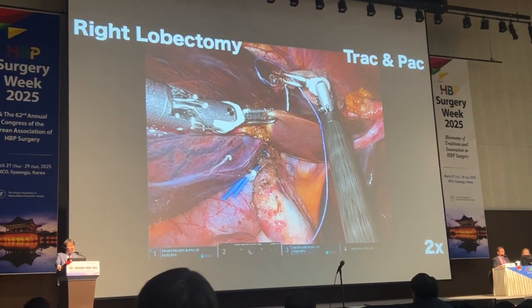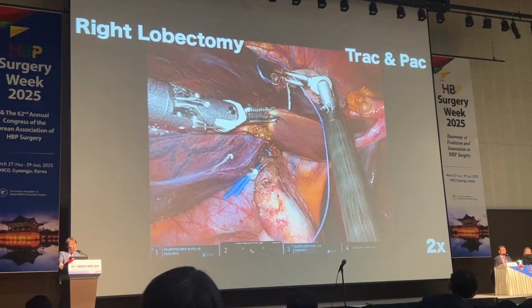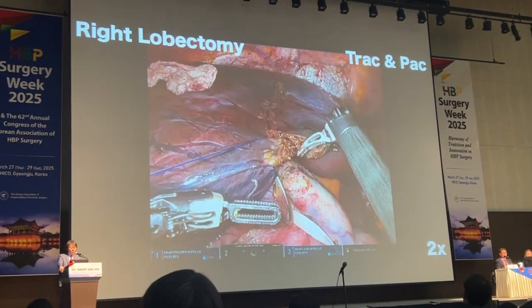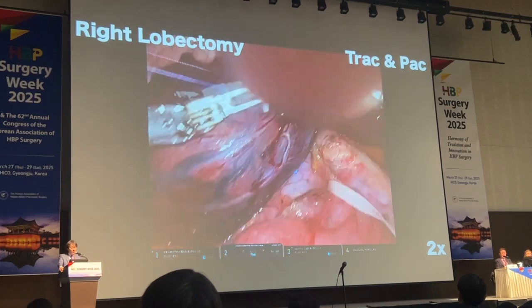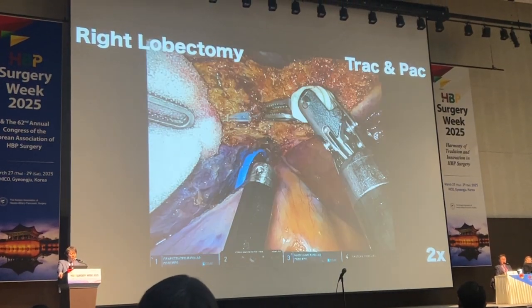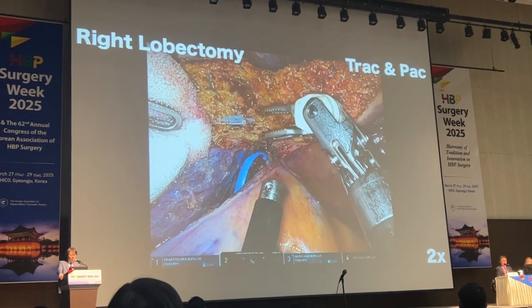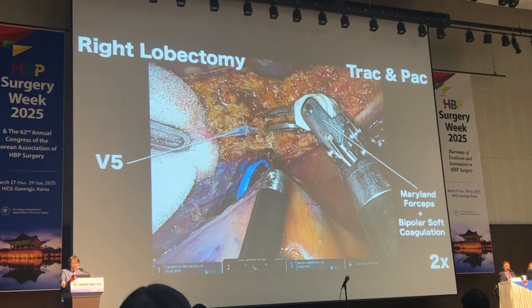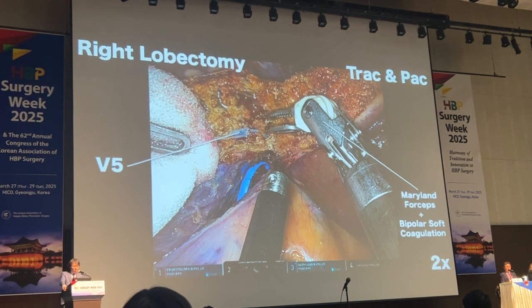This is a video of a right hepatectomy for a patient with normal liver. The first point, probably one of the most important points, is to create a basic position by the traction of the suture, then pull outward the cut surface of the liver parenchyma with the left arm and apply sufficient tension. This is the segment 5.